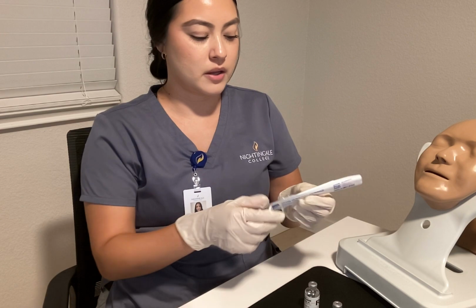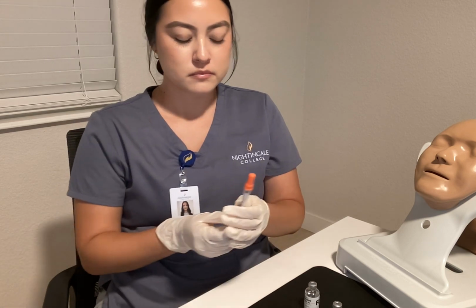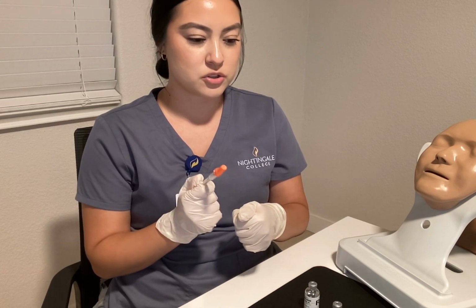From here, we're going to go ahead and get our syringe and needle. So before we actually draw up the medication, we're going to inject air into both.